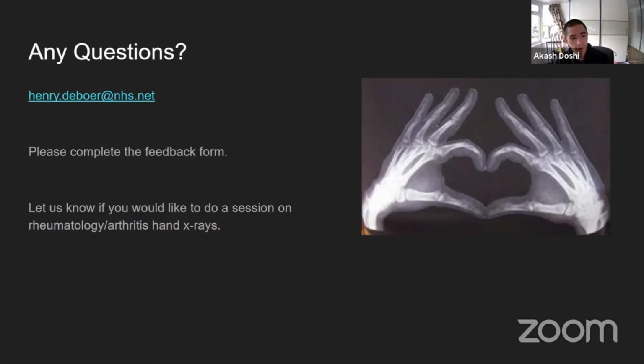Thank you. Yeah, one question, sorry, I'll just answer this. Difference between a mallet finger and bony mallet. So a mallet finger is the deformity, where it's a flexion deformity. Bony mallet is where there's a fracture causing that.